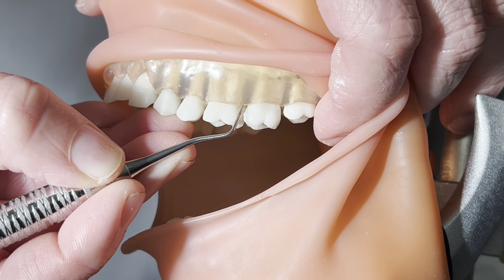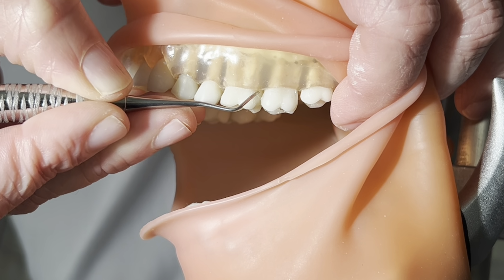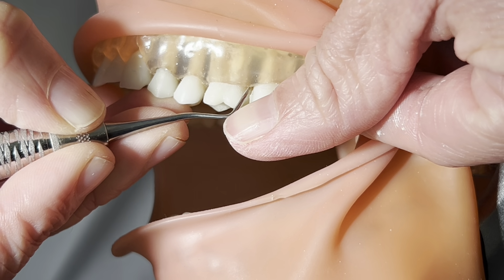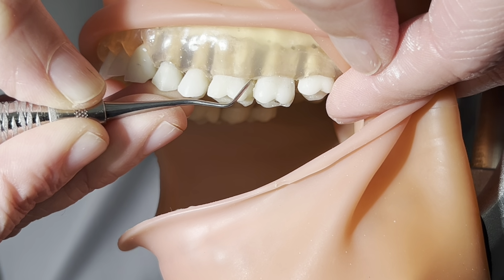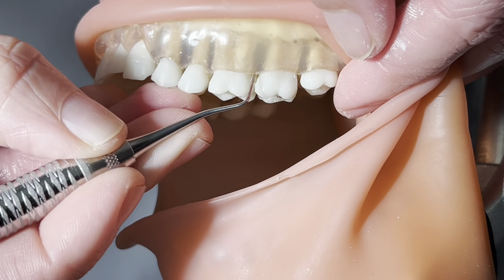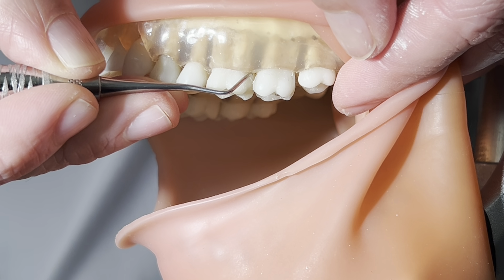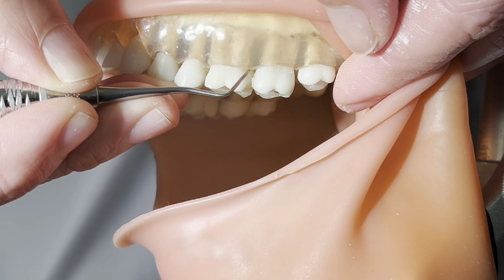So the easiest way to achieve that is just to bring the instrument blade closed. You can look at the heel of the instrument. It's going to come closer to the tooth surface for 70 to 80. We're not going to exaggerate it too far. So 90, 70 to 80. Correct angulation for a calculus removal stroke.